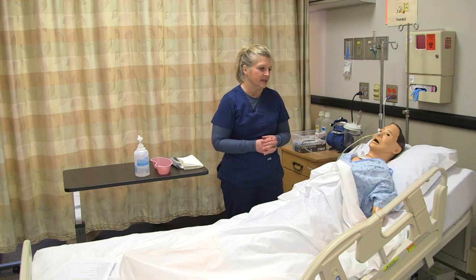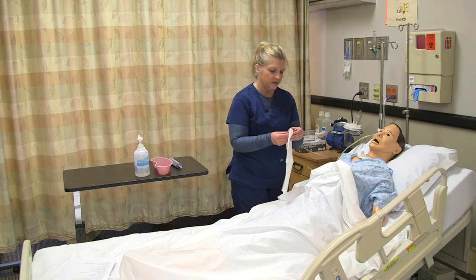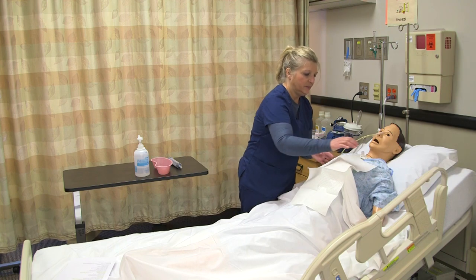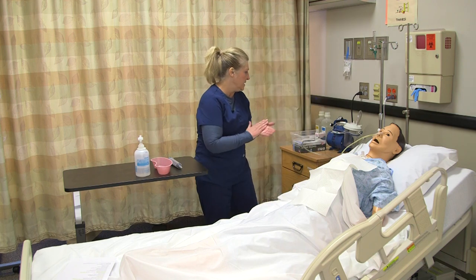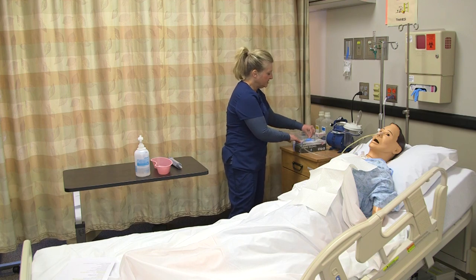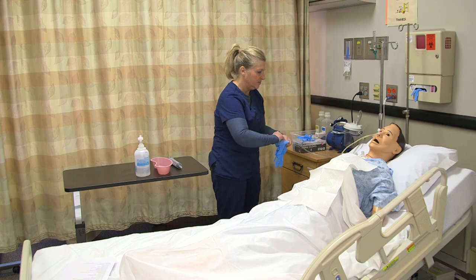I want to make sure that I'm documenting that as well. Then I'm going to put a non-permeable towel or barrier on the patient's chest, because when I remove it there might be some secretions. I'm going to wash my hands and place gloves, and I'm also going to disconnect any suction that might be on.